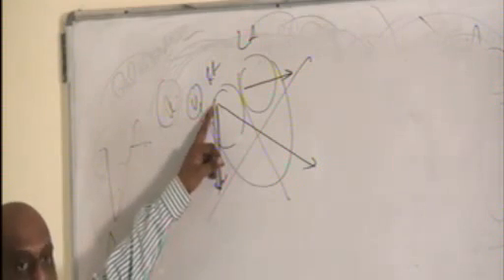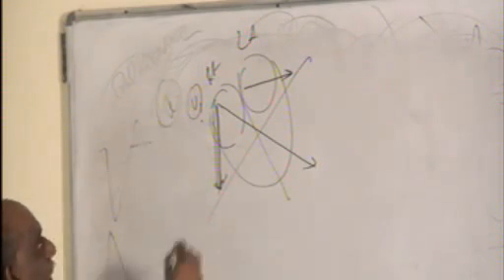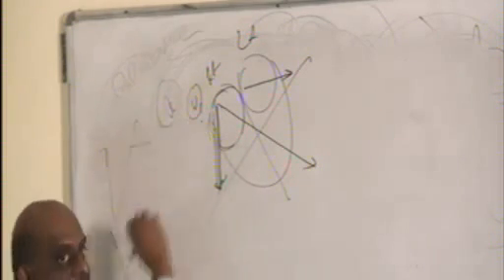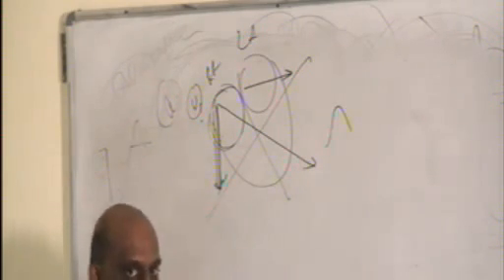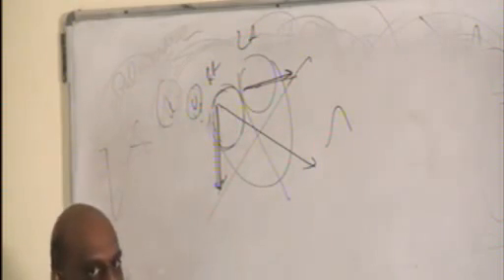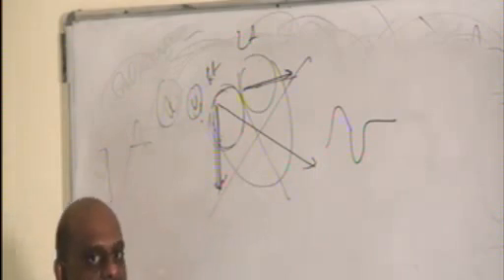So if you take the P wave in lead V1, right atrial activity will be on the right side, and V1 is on the right side. That's the reason it leads to a positive deflection, but left atrial activity is leaving V1. That is the reason you get a negative deflection.